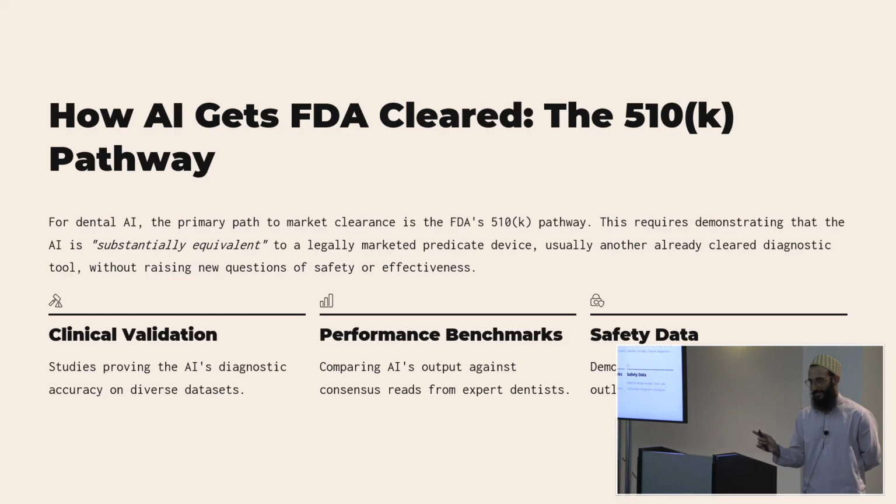In the very early days, when the models were still okay, pre-clinical trial, I built a tool so that as soon as a radiograph was sent to Pearl, the image detection would happen by the AI, and it popped up in front of an actual dentist. The dentist would double check the image, and if there was a false positive, they would just X out of those images.